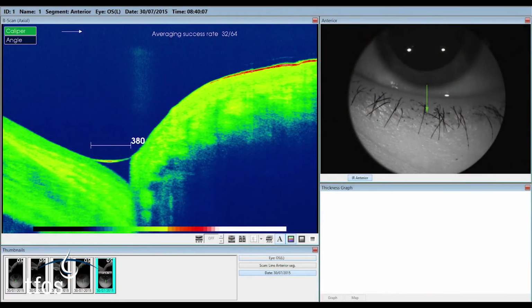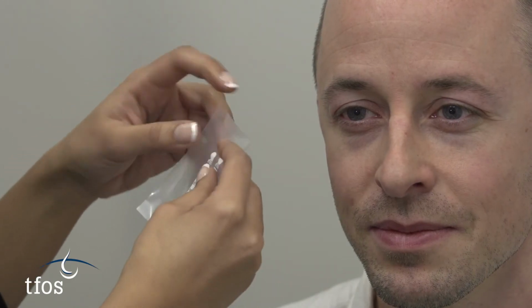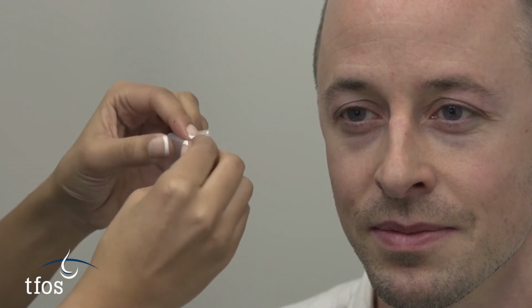Optical coherence tomography, or OCT, can be used to get a cross-sectional image through the tear meniscus profile, from which the area can be quantified and the actual volume estimated. More invasive ways to evaluate tear volume include the phenol red thread test and the Schirmer test.